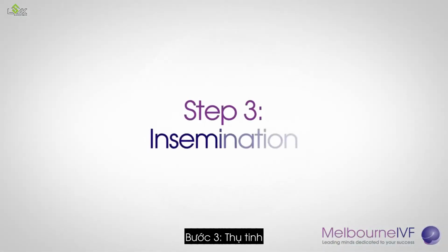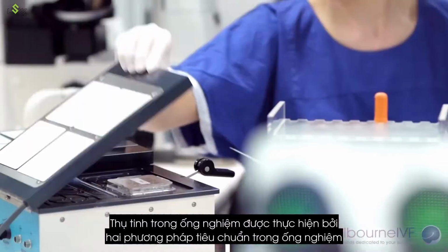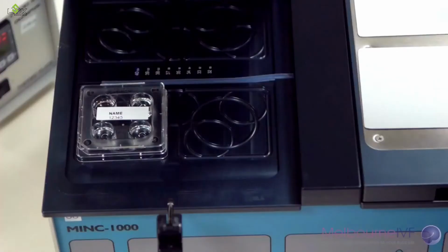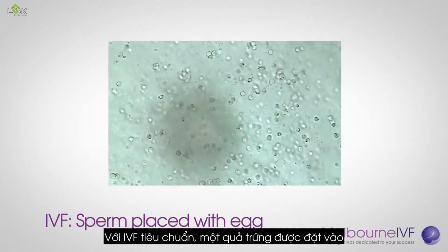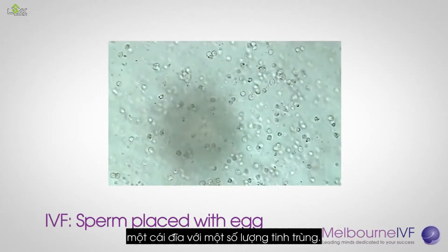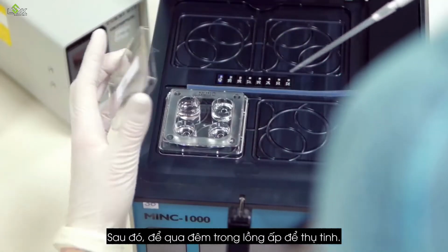Step 3. Insemination. IVF is performed by two methods: standard in vitro fertilization, or IVF, and intracytoplasmic sperm injection, or ICSI. With standard IVF, an egg is placed into a dish with a large number of sperm, then left overnight in an incubator to fertilize.